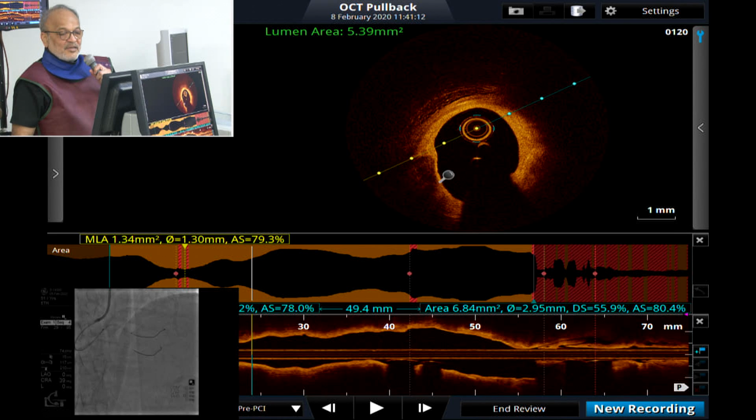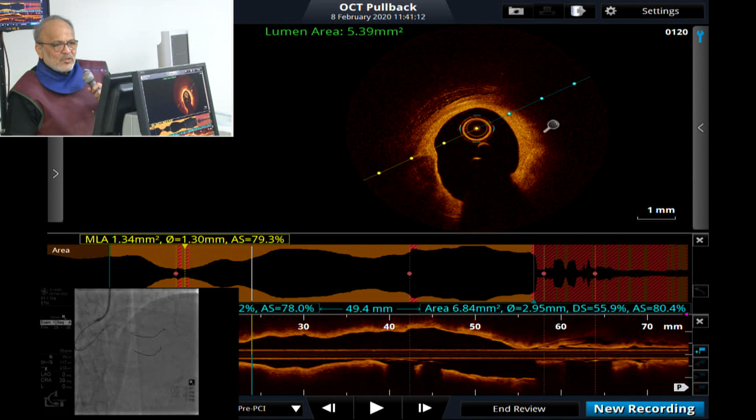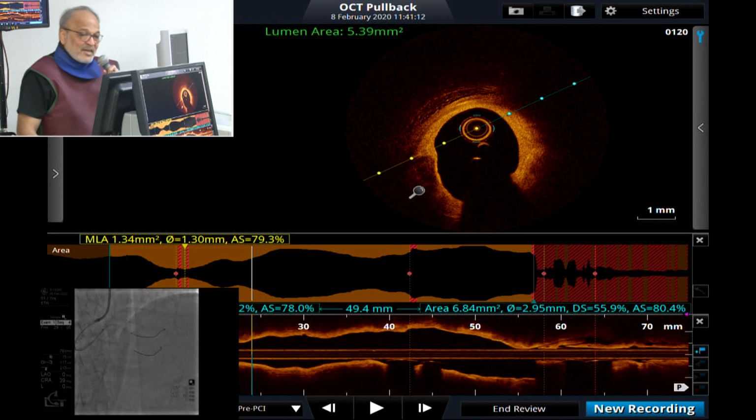In this region it might be calcium. This is not calcium, this is fat, right? This is cholesterol. It looks like fat because the whole area from here to here is surrounded by fat. But as you rightly notice, there is some filling of a little bit of calcium. It is very interesting.